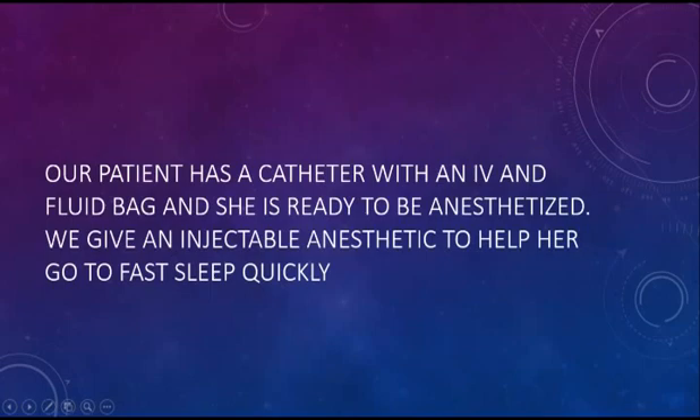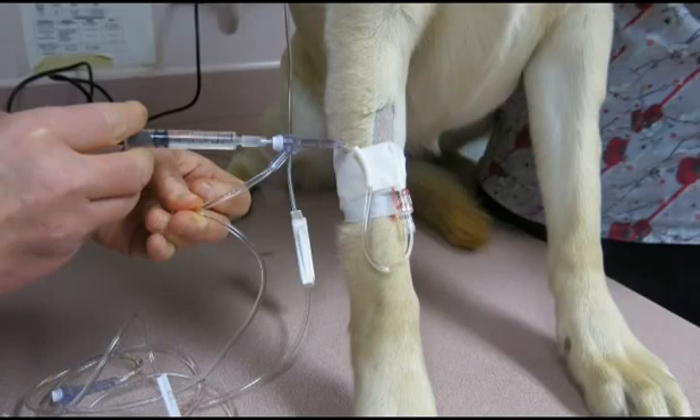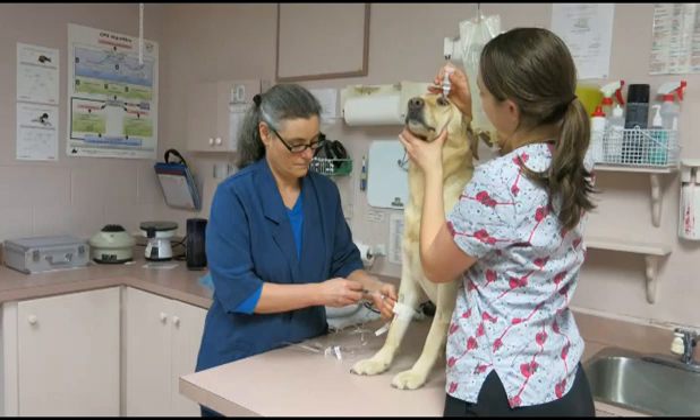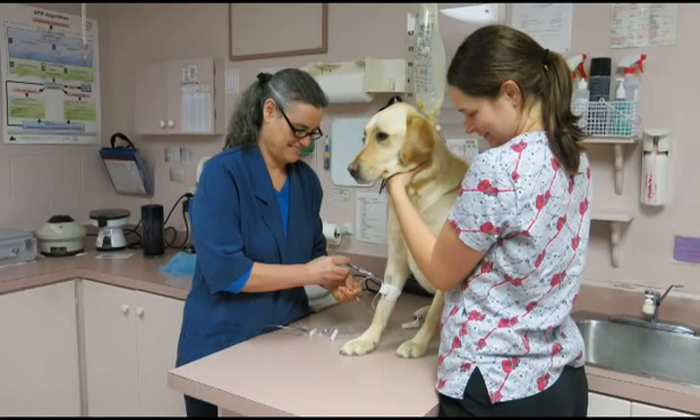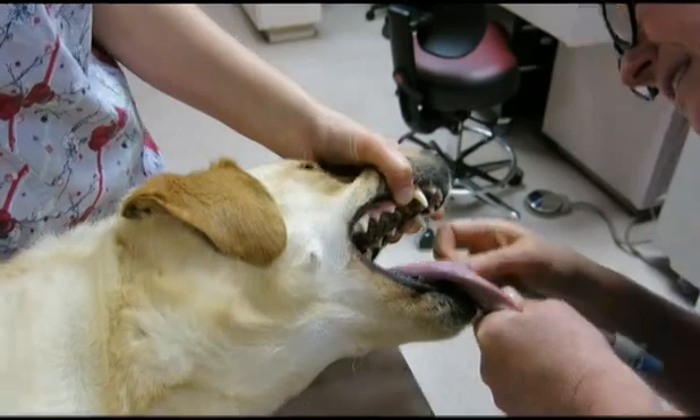We give an injectable anaesthetic to help her go fast asleep quickly. Here I am giving an anaesthetic to my patient, and my animal health technician is placing drops in my patient's eyes so that the eyes do not dry out during anaesthetic. Here is my patient feeling very sleepy.